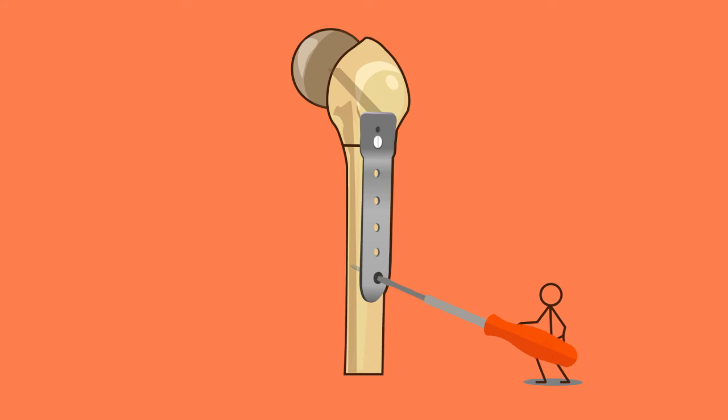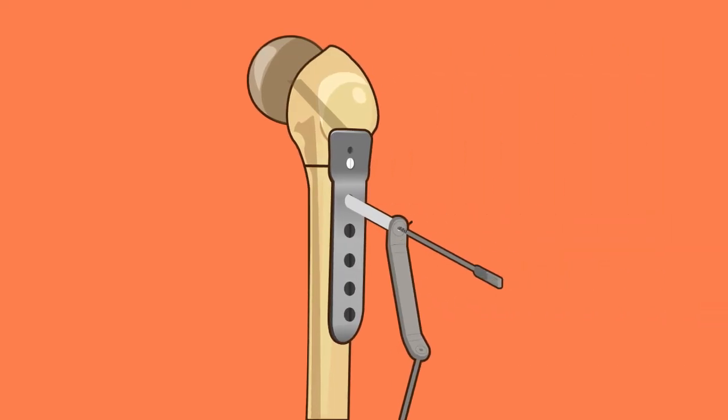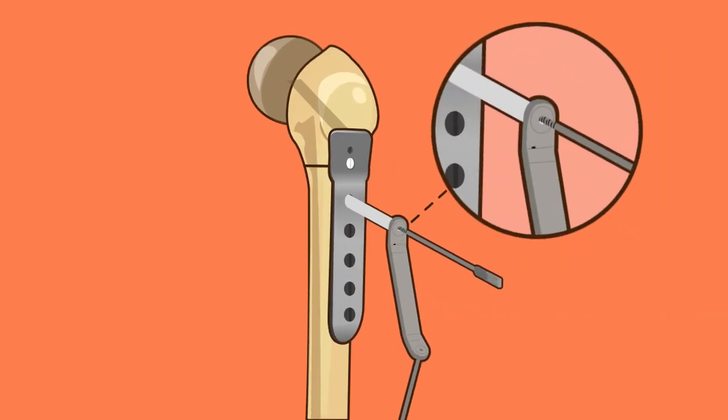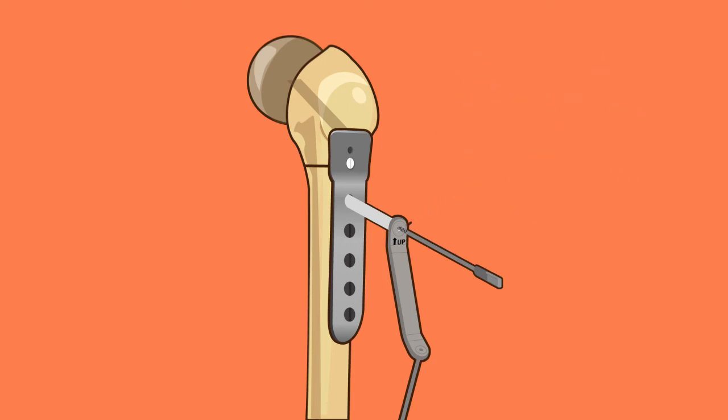Step 12: osteotomy compression, optional. When compression of the two segments is desired, the compression sleeve can be used with the up arrow pointing towards the blade. Drill through both cortices and note the screw length required. This will achieve one millimeter of compression across the osteotomy.